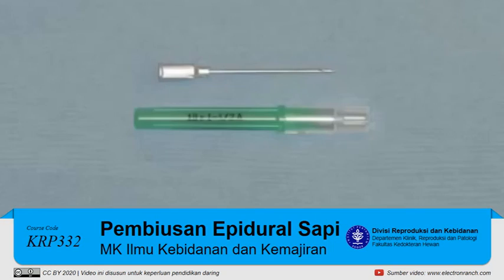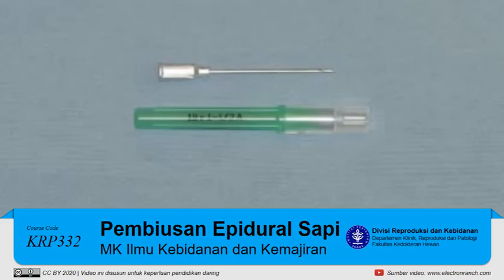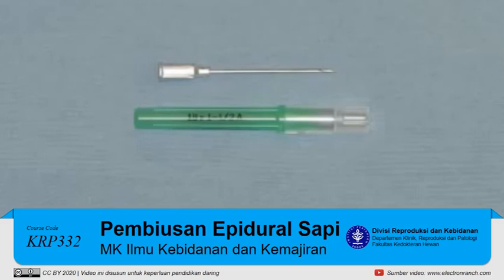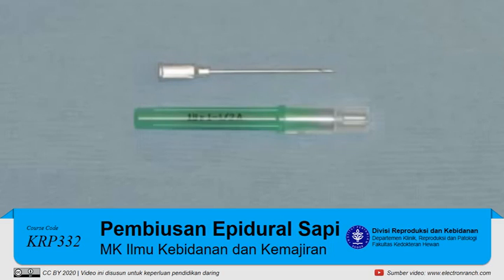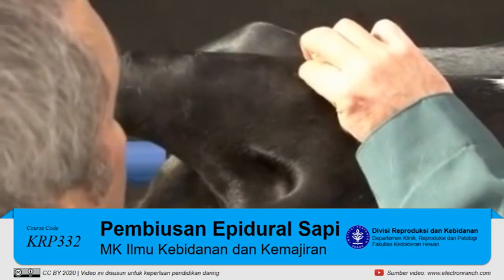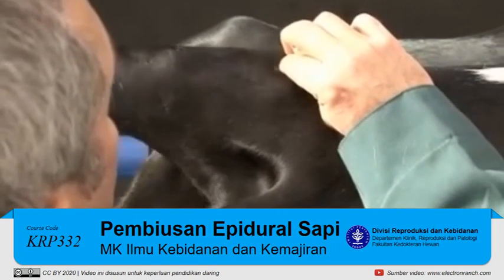An 18-gauge, 3.75-centimeter sterile needle is generally used to deliver the anesthetic, except in very large patients who may require longer needles. Locate the space with your finger and insert the needle on the dorsal midline directly over the space.